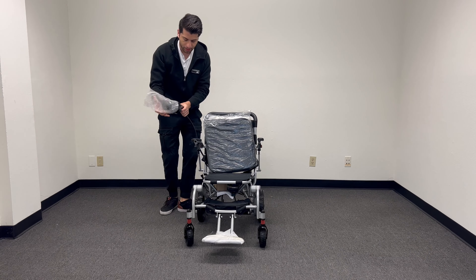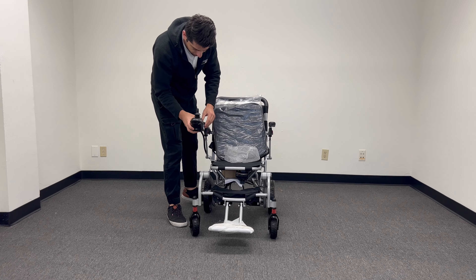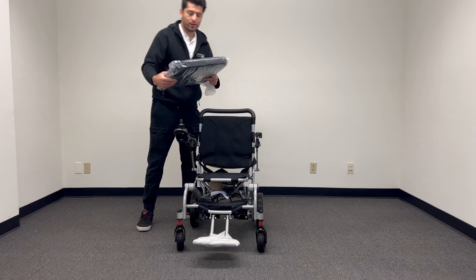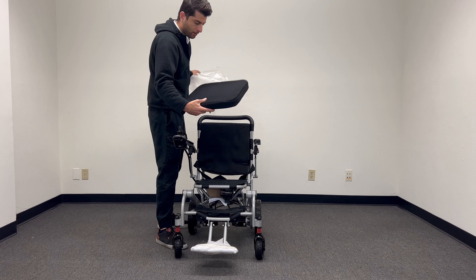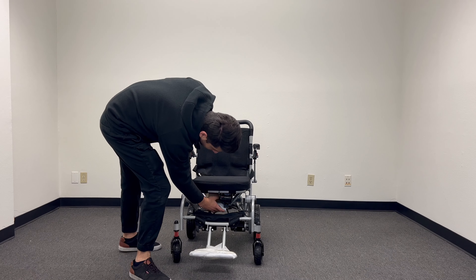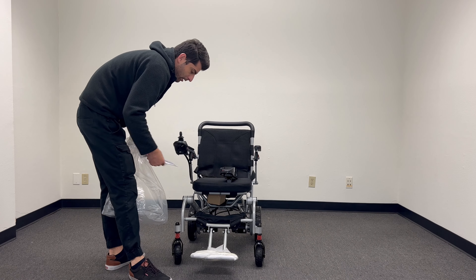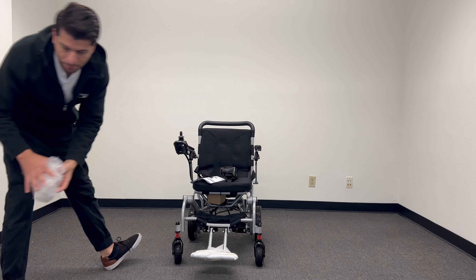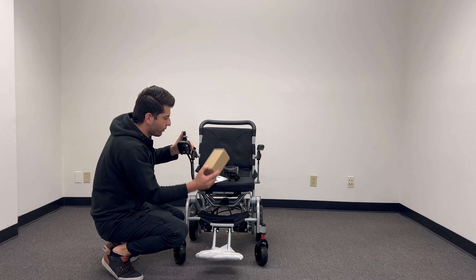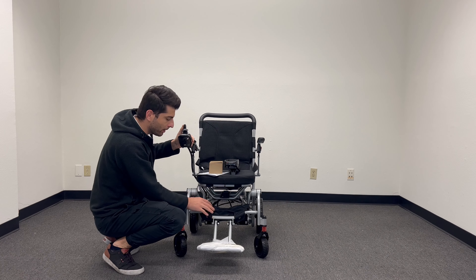This is our first thing. And here is our cushion. We also have the charger right here. And we have a supply bag — you can keep the materials in the back.